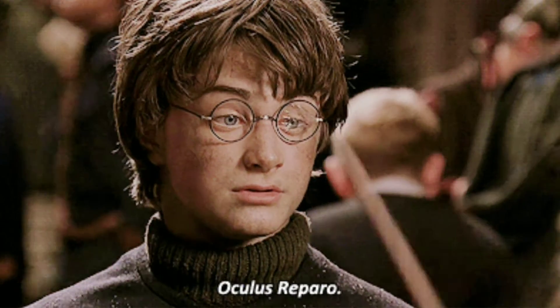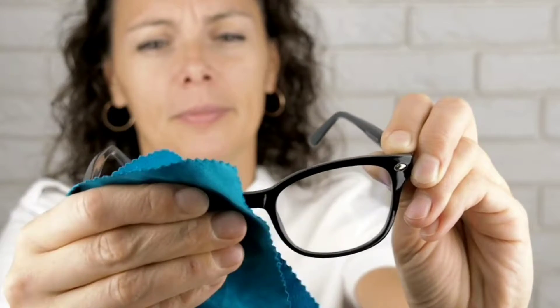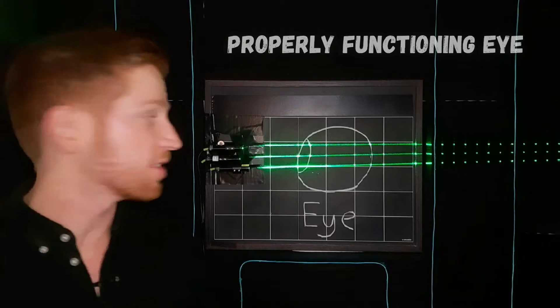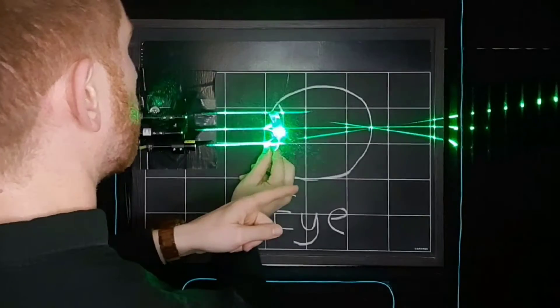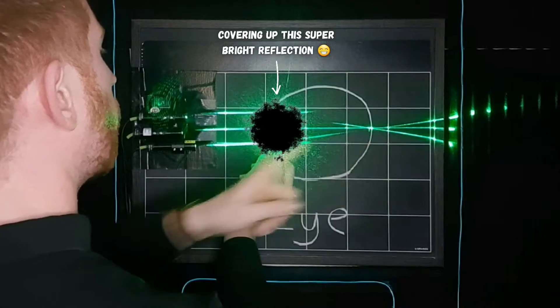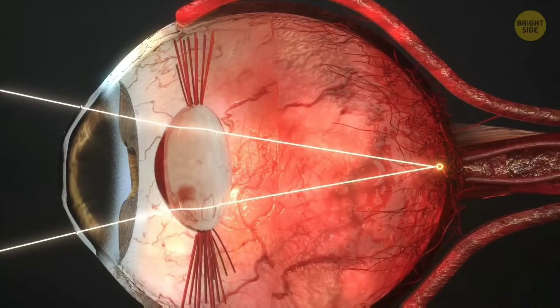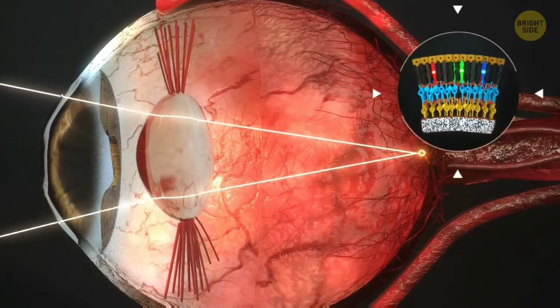All glasses and contacts correct your vision by shifting the light in your eyes to focus on your retinas properly. So if your eye is working the way it's supposed to, it looks at something far away, takes in that light, and focuses that down onto a single point on your retina. That's the back surface of your eye that has all of your light detecting cells.